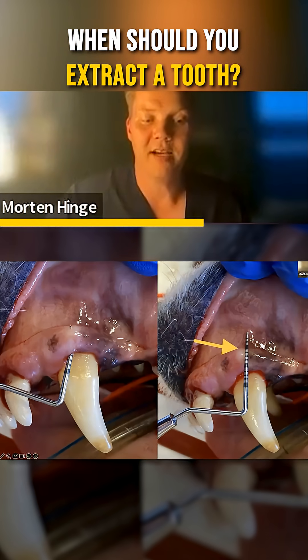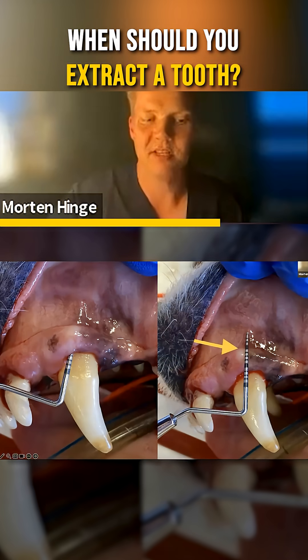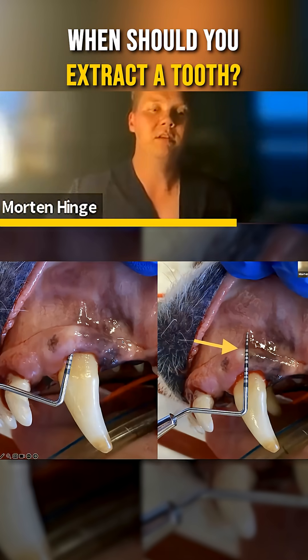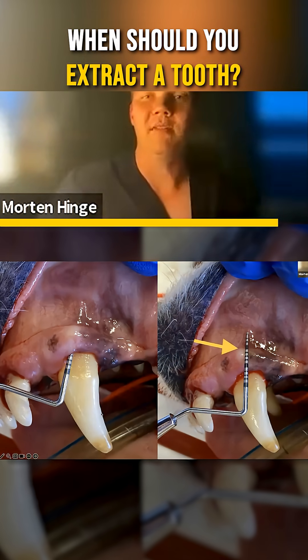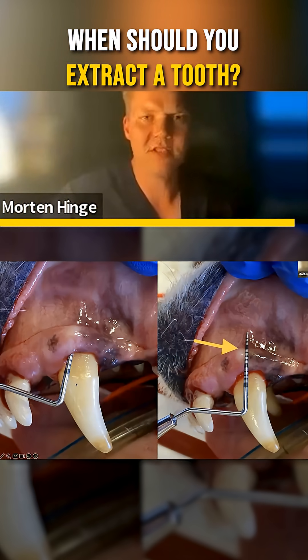Just keep in mind: if you can probe through this line up into it — don't force it, but if it just slips in and slides all the way down — you can confidently tell the owner this is not going to get better. There's no possible way to clean this without an advanced regenerative procedure to save the tooth, which is often not feasible. In this case, it's an extraction.